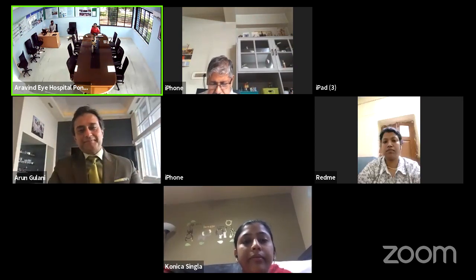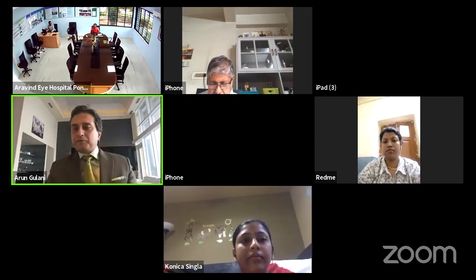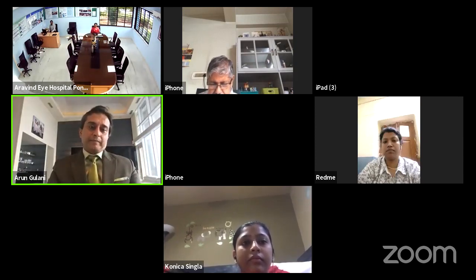Thank you so much, Dr. Gulani. I guess the questions are over. I hope there are no audio questions. So if that's so, I see some chats coming in, but why don't you ask the audience what is their take and what has been their success in this surgery? Because I'm sure someone else has another great idea.